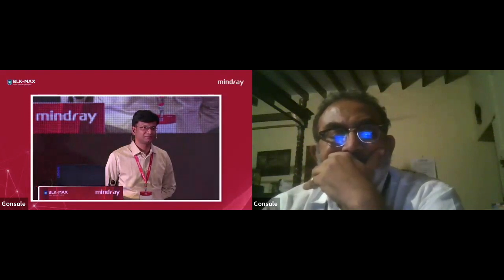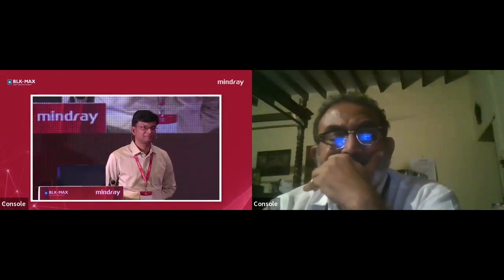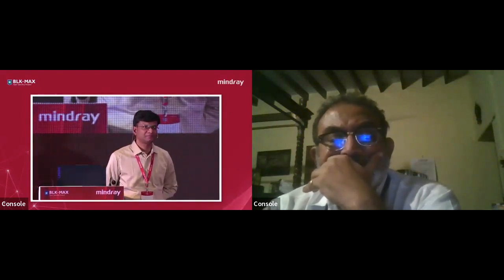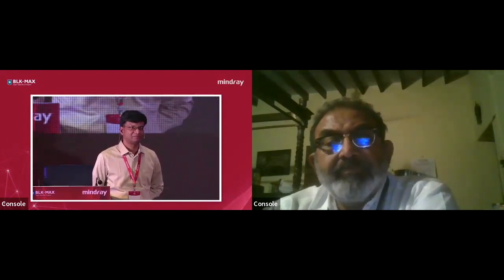Yes. And that's a surprise to us, because in our cases we have most of the time found that in MDS the IPF is low. In fact, that used to give us the confidence to report it as MDS, because we thought it was going to be low. Now, there were 2 or 3 cases in which the IPF was high and they were MDS, so we were very surprised at why. But I think we should have been surprised the other way around, considering what you have found. This is a new thing for us to figure out, that the IPF in MDS is actually high, whereas we always thought it's low. But probably you've given the reason as mentioned in that paper. They are mentioned in the literature.